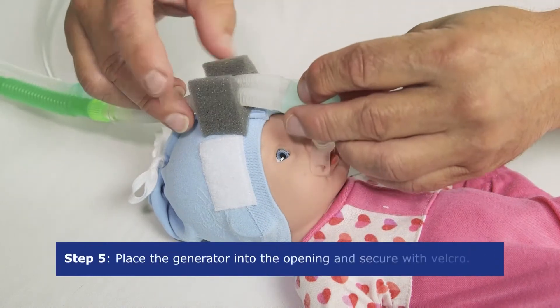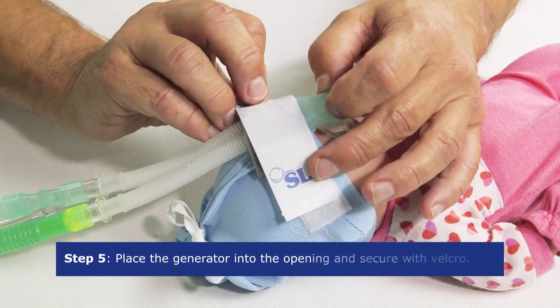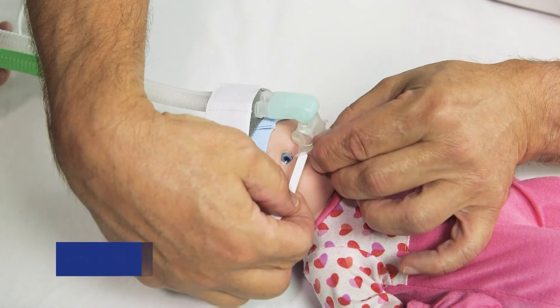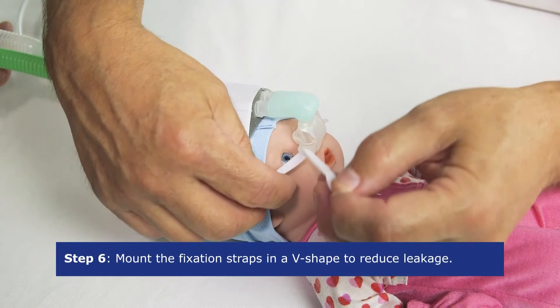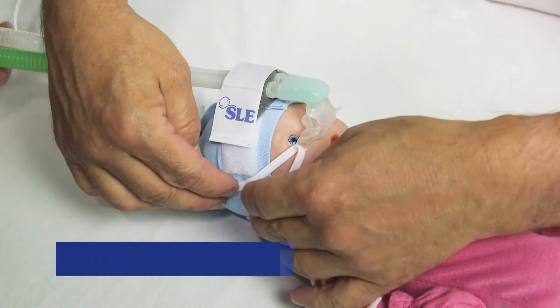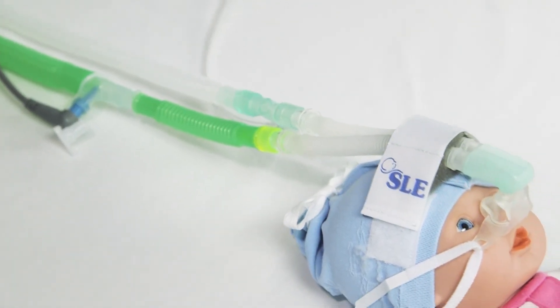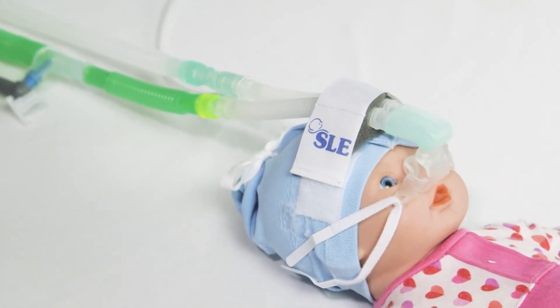Close the velcro strap tightly over the tubes. Use the fixation straps to hold the mask or prongs in place and reduce leakage. Mount them in a v-shape either side of the bonnet. Finally, recheck the correct placement of the mask or the prongs.